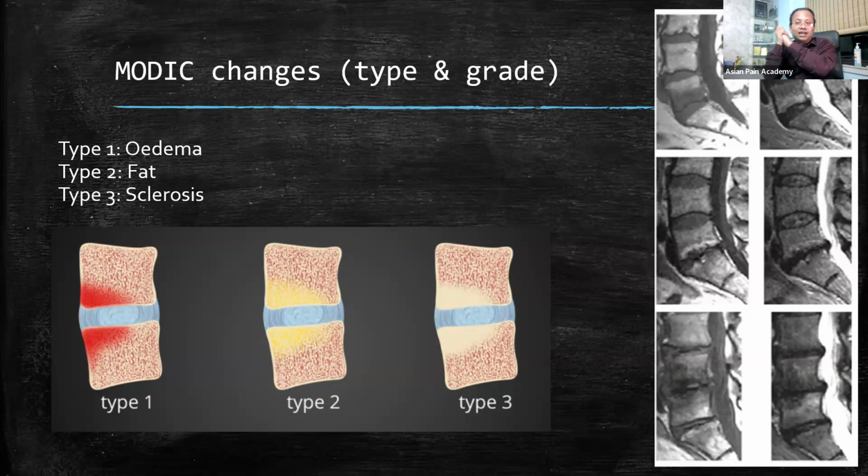Second benefit, what is that? That is, it shows the inflammatory changes. So it can show inflammatory changes anywhere. Say, as I told you, osteomyelitis, it is the bony edema, infection edema, or say simple metastasis of a bone. So there also edema will be there. So it shows those areas and tells you that okay, edema is there, means either inflammation or infection. One thing will be there.